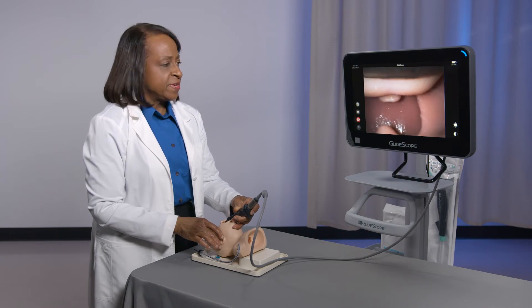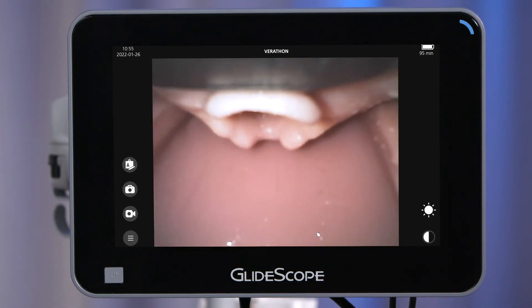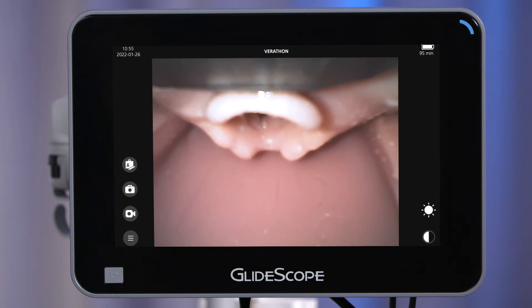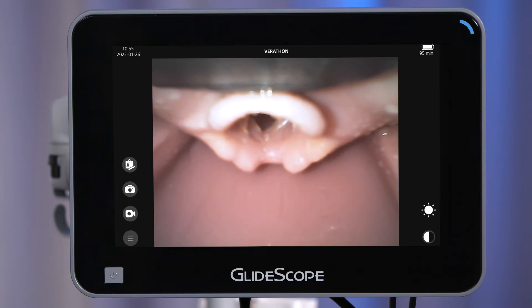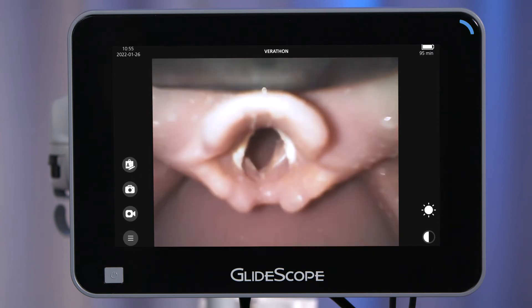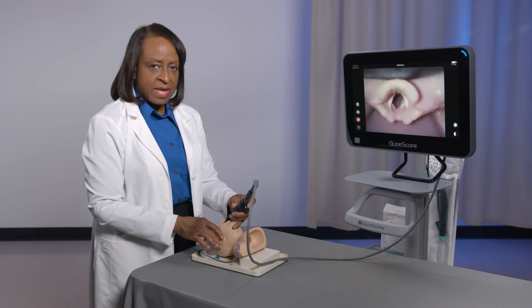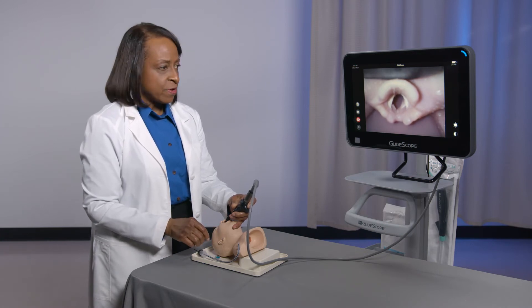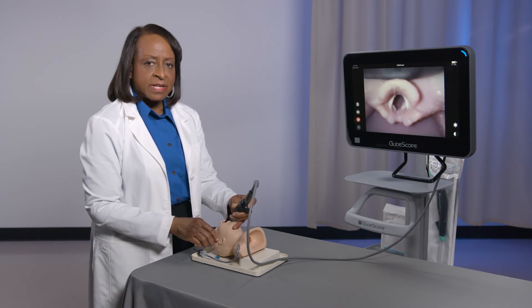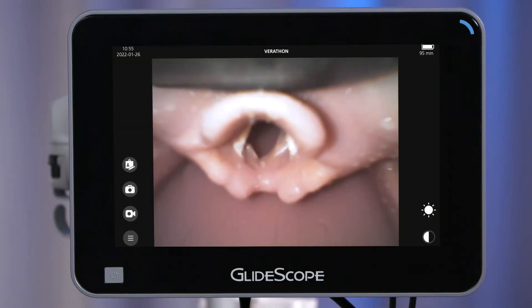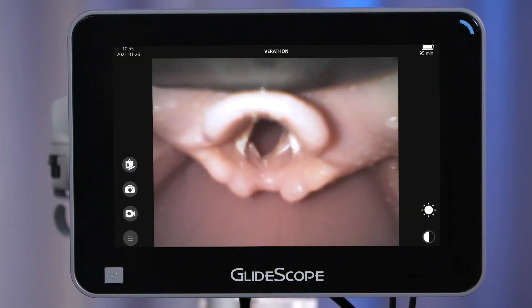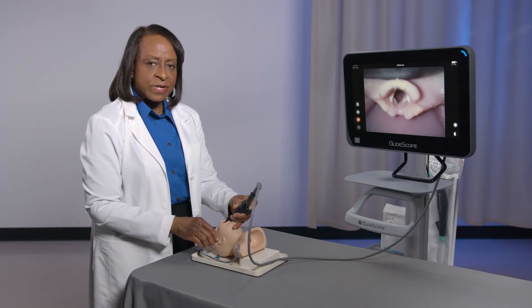In step two, look at the video monitor. You will now be able to see the tip of the blade. Advance the blade, identify the epiglottis, and place the tip of the blade in the vallecula as you would with a Macintosh-style blade. Ensure that you do not position the blade too deep. You should be able to see the tip of the blade in the vallecula, and this blade position allows you to effectively manipulate the epiglottis and expose the vocal cords during intubation. This optimal positioning of the blade provides a panoramic view of the oropharynx.